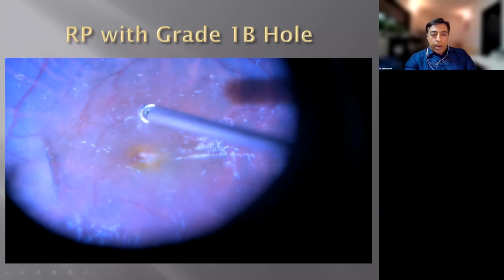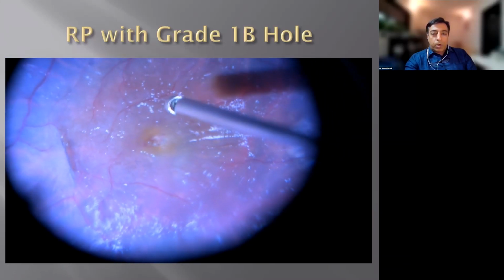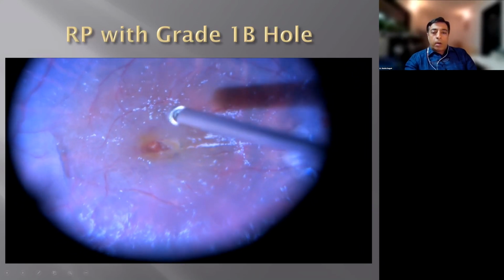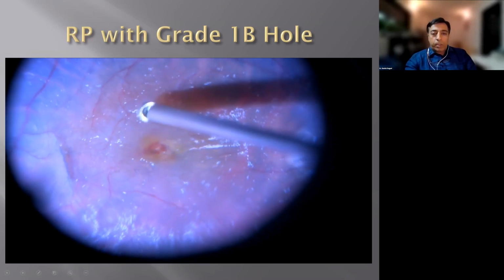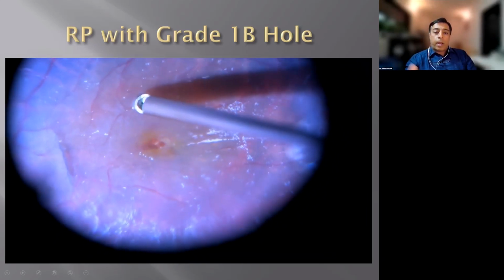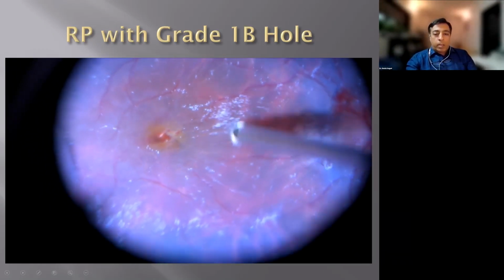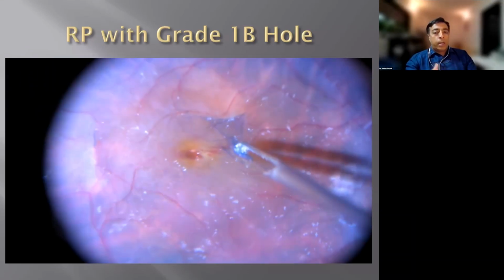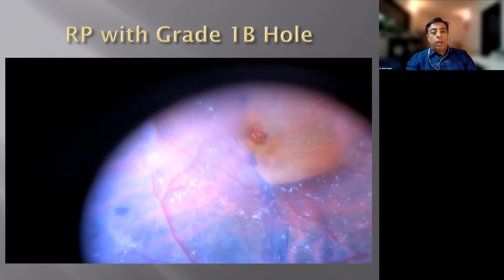Now keep watching the macula. Keep watching. I'm just aspirating the residual triamcinolone with low suction, and can you see suddenly what happens? Suddenly that hole tends to open up a bit just because of that suction. And this is something I've noticed in some cases that happens randomly, and one has to be careful. It's probably a very small roof to that hole which was attached, and it has come up, and that's what probably causes this phenomenon.